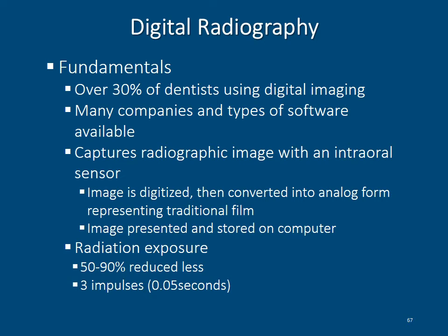Within our clinic, the radiation exposure is reduced by 50%. And even though we do not have the best, most high quality sensors, those sensors ran between $5,000 and $8,000 a piece.